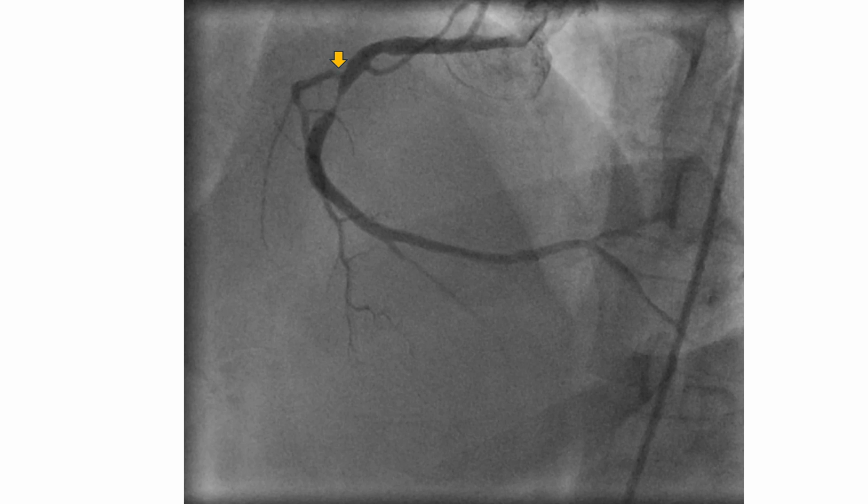But the lumen starts tapering from the region of the side branch and the side branch ostium appears hazy. Hence, while stenting, the flow to the side branch is likely to be compromised. As it is a small branch, there may not be much problem due to compromising the side branch flow.